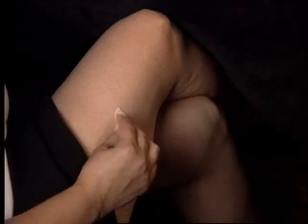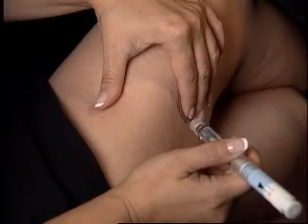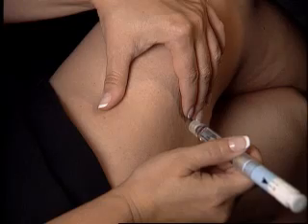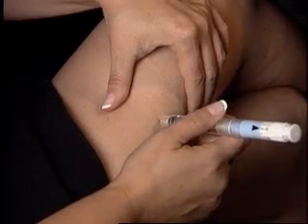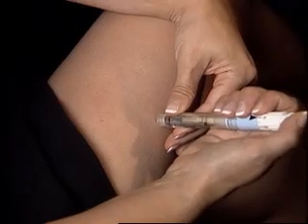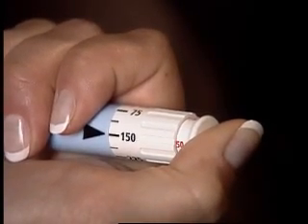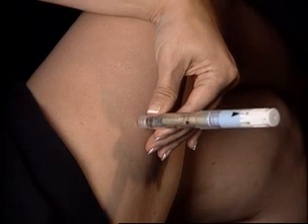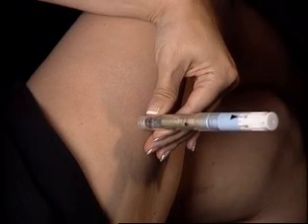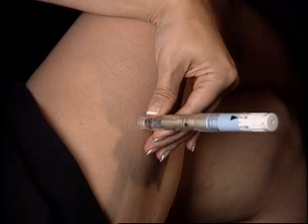Cleanse the site with an alcohol wipe and allow to dry. Hold the pen and with a dart-like motion, insert the needle into the skin. Steady the pen with your other hand and inject the contents by pushing down on the injection button at the top. Count to 5: 1, 2, 3, 4, 5. When the injection is complete, quickly pull out the pen.